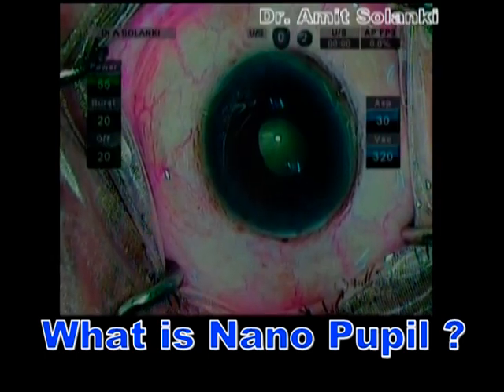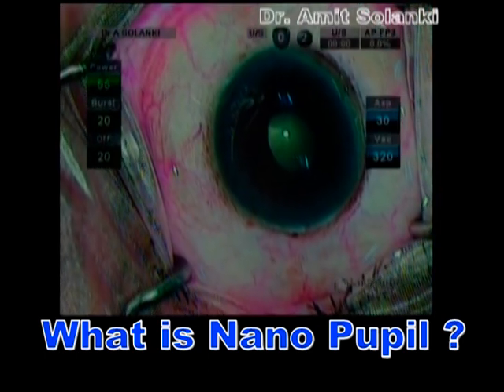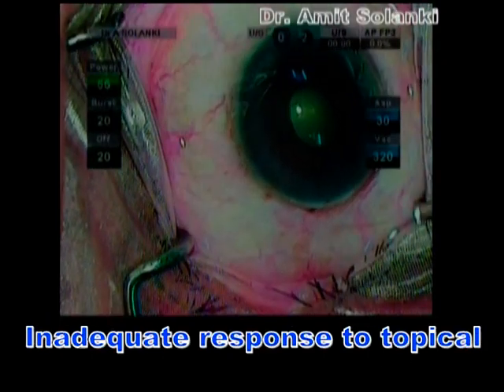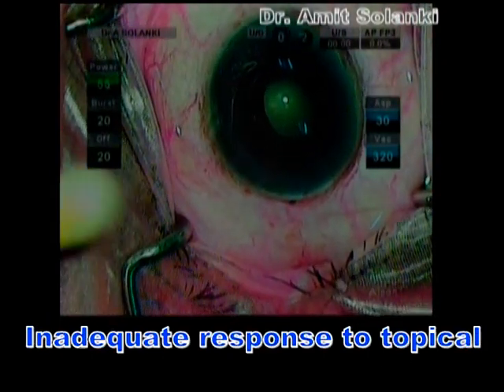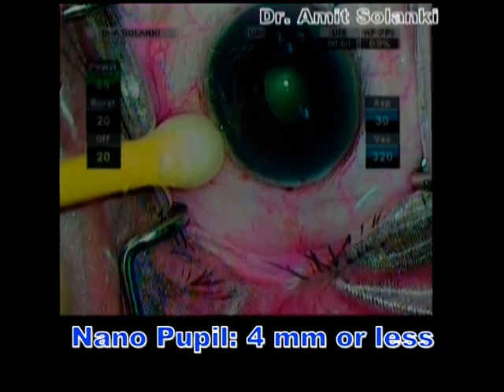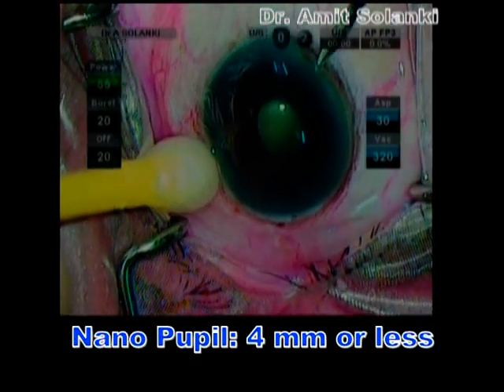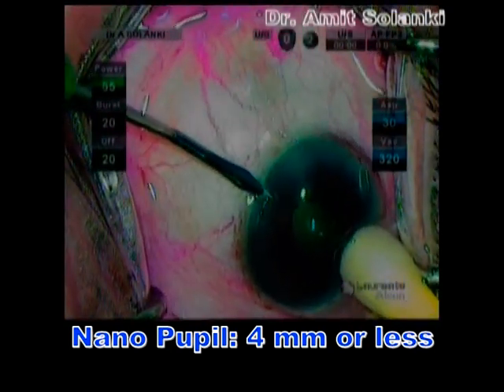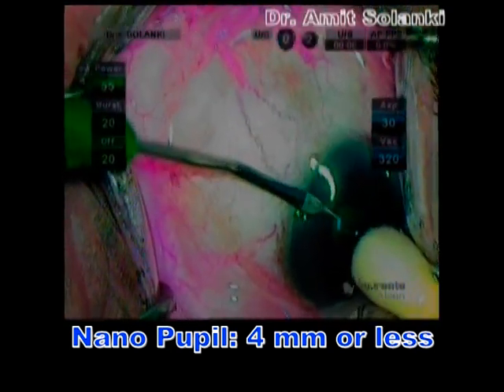One of the most important things in cataract surgery is pupil size. Unfortunately, in many patients, there will be inadequate response to topical or intracameral mydriatic agents, resulting in a small, poorly dilated pupil of about 4 mm in size, and that is what is termed as nanopupil.